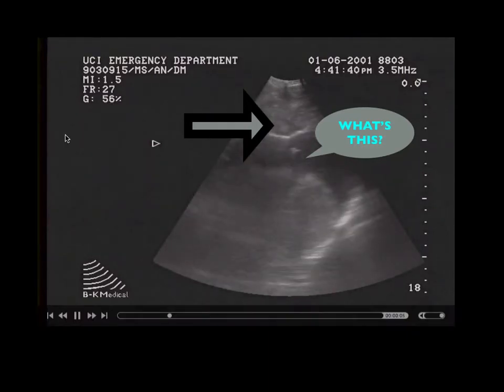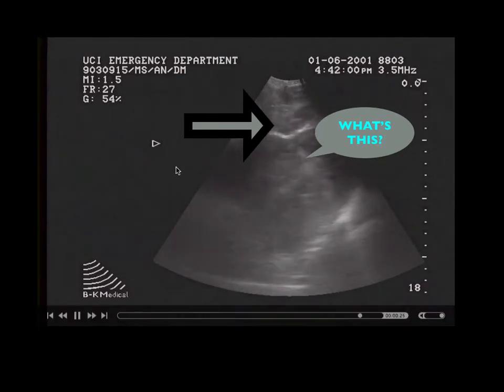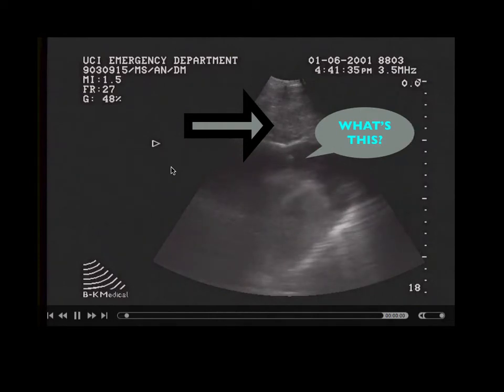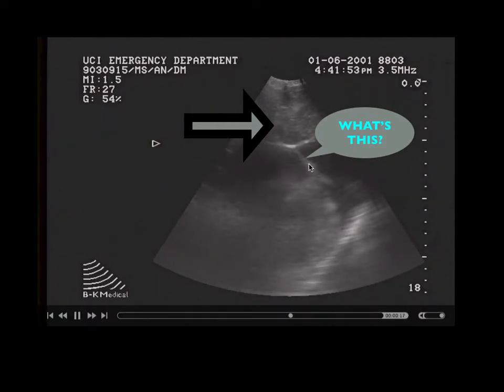Over here, there's an arrow pointing to something going on in the liver, with the question of what's this? This is the subxiphoid approach, and this is a needle entering the pericardial sac, and you'll notice there's some fluid around the liver. The liver is getting a small tear in it with some bleeding. And that in itself is not a big deal and happens quite frequently. You'll see later on there's a shadow that comes in here, and that's actually a guide wire that's coming in, and a catheter will follow. Tamponade is readily visible, and we'll explain shortly why there's the catheter, by the way.